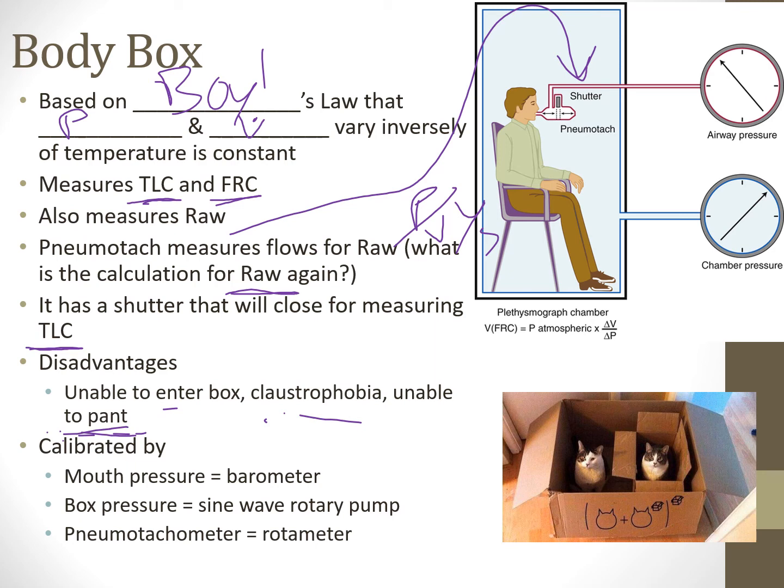So you have to put your hands over your cheeks and then puff, or pant, I should say, for the airway resistance maneuver. And some people may be unable to coordinate that type of breathing as well. So some of those are disadvantages.